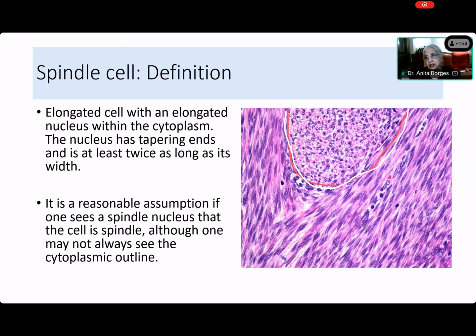Okay, when you cut a fascicle and you see all these cells that are running parallel to one another and parallel to the direction in which that is running, these are fascicles. And when you cut a fascicle transversely, you can see. So if I want to cut this fascicle transversely, let's try that experiment. If I cut it like this, what do you think it will look like, Shashank? What will those same cells which are spindly, now what will they look like? Are you there, Shashank? So what will they look like?